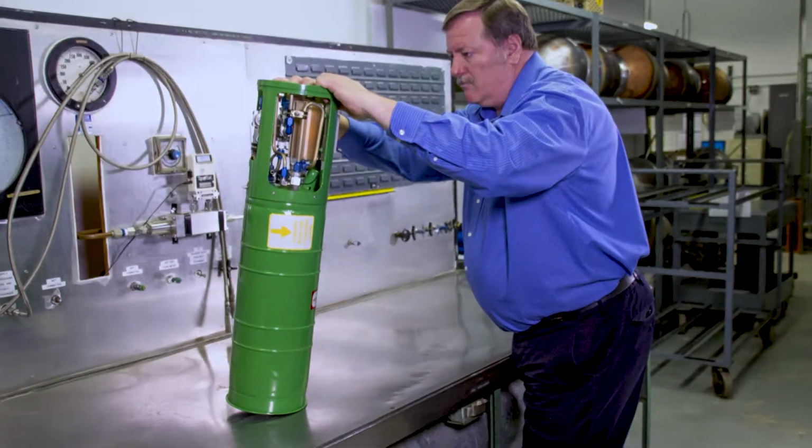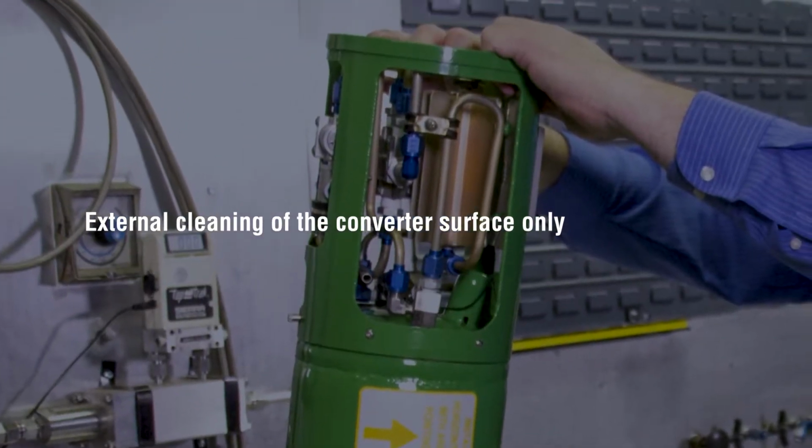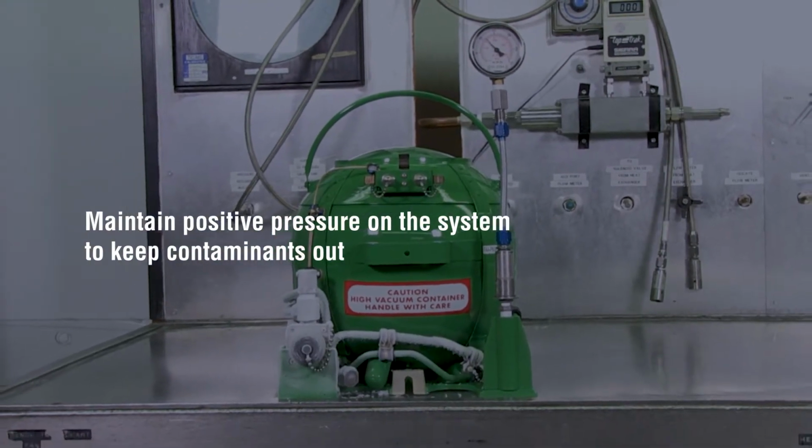When cleaning of the units is required, it should be limited to external cleaning of the converter surface only. Make sure there is positive pressure on the system to keep contaminants out.